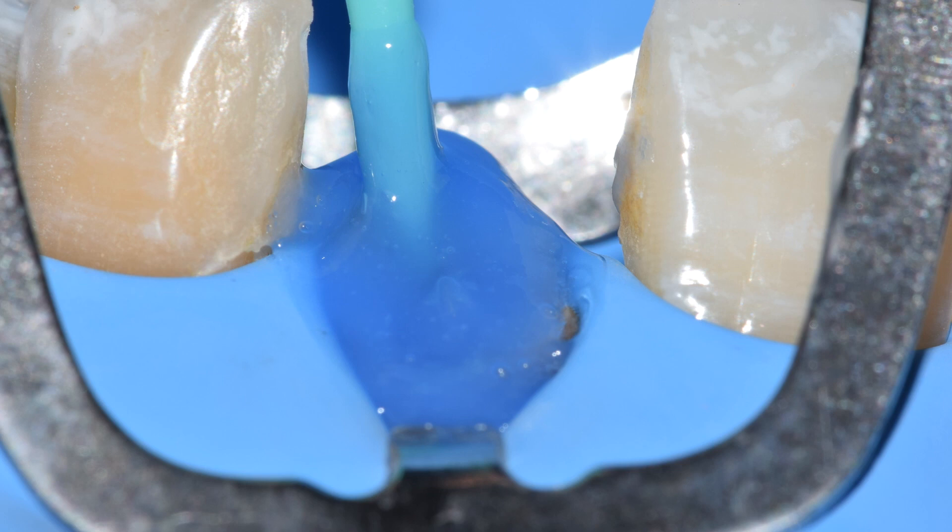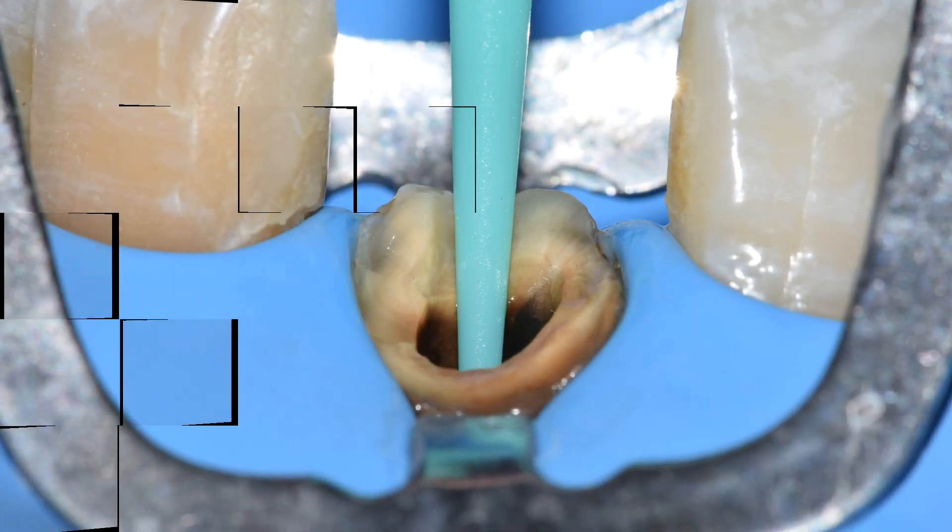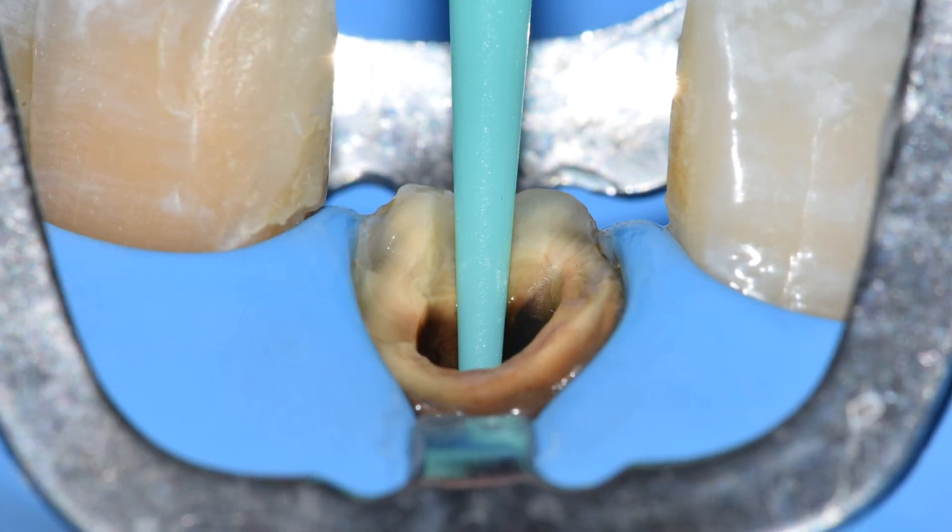Once the post has been cut, the next step is to etch. When it comes to etching, it is necessary that we actively scrub the etchant because you want those perfect resin tags to form. Once the etchant has been washed, the next step is to bond well and apply adhesive well. Once the etching and bonding step is completed, the next step is preparation of the prosthetic crown.